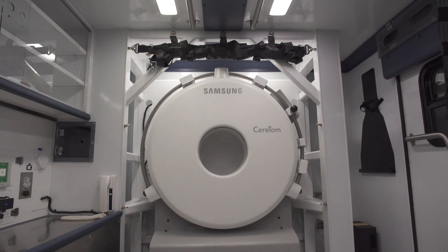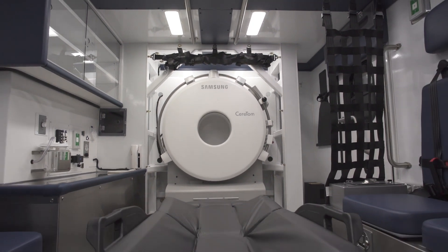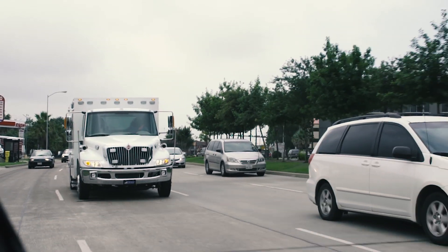One of the most important things is keeping the medics in the back safe, and that comes from a lot of design aspects. Fraser has a long history of building very safe units, so safety is obviously paramount — whether or not there are standards that say we have to contain the CT scanner in place, this is something we absolutely want to be doing.